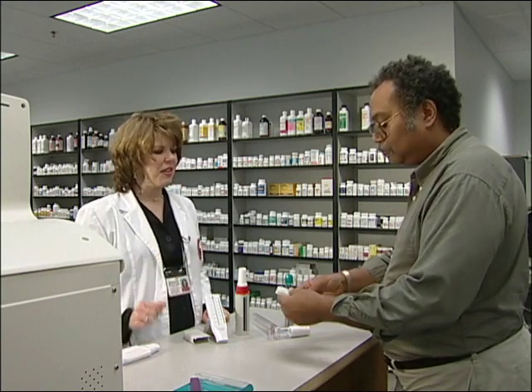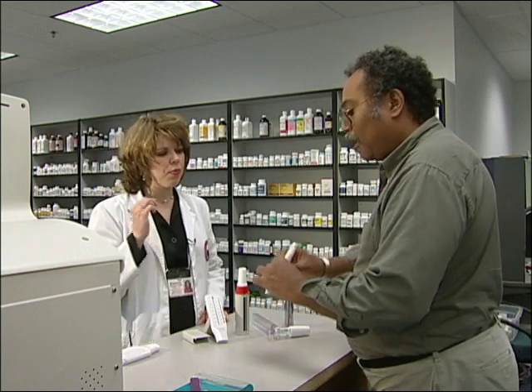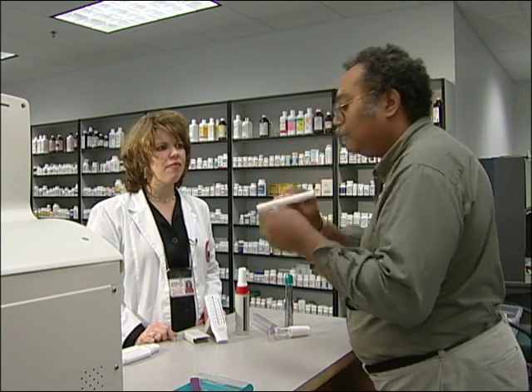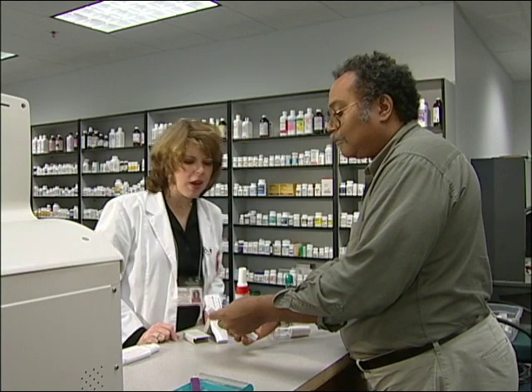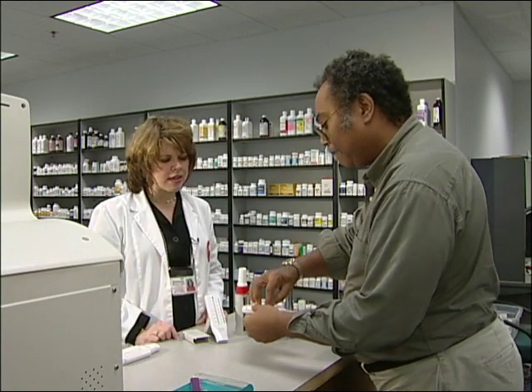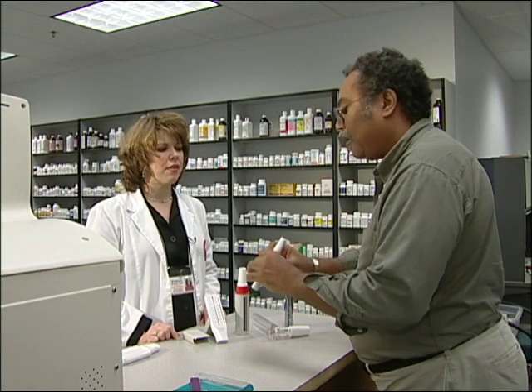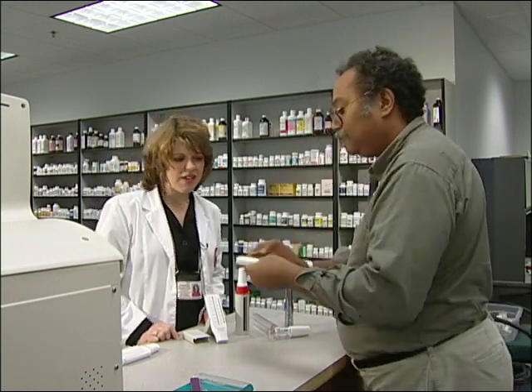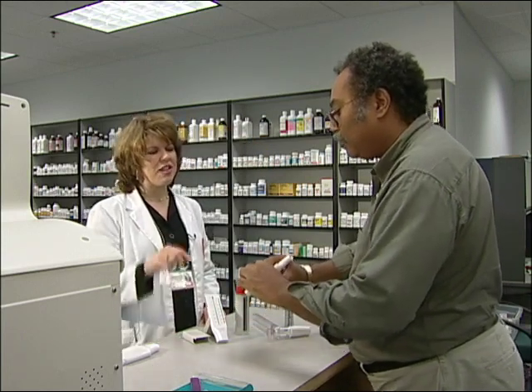So let's see you do it and make sure you're doing it correctly. Take a deep breath in, wrap your lips around, and blow hard. Around 340 — take your finger and move it back down to the bottom. One more time. You're getting better — you're up to 420 that time.